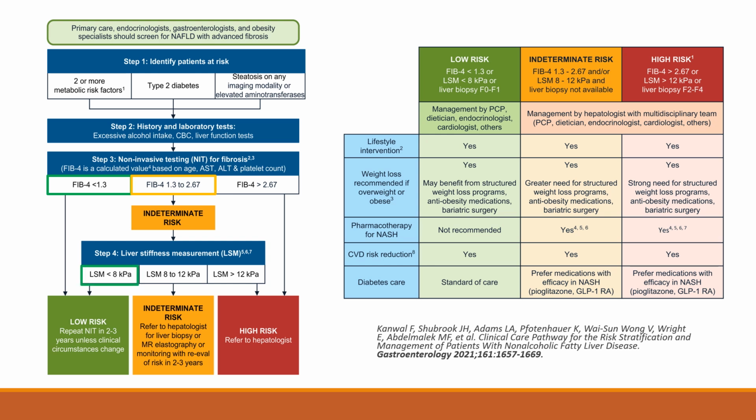A liver stiffness less than 8 kilopascal brings patients back to primary care, while values above 8 and especially above 12 warrant hepatology evaluation and more aggressive management of metabolic disease, preferably with agents with direct or indirect hepatic benefits such as GLP-1s and pioglitazone.